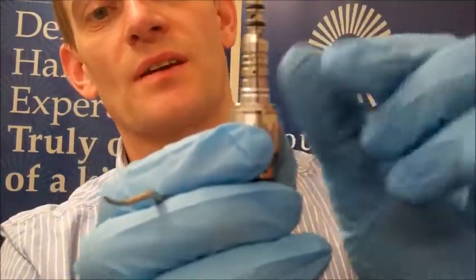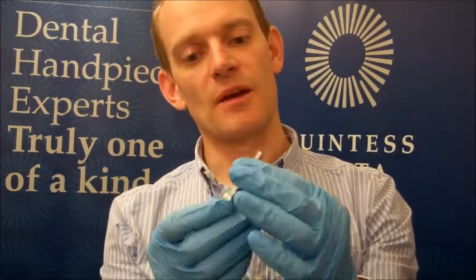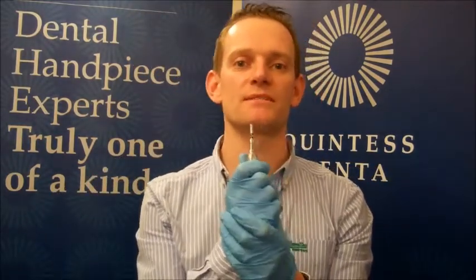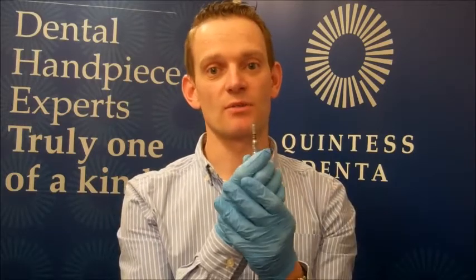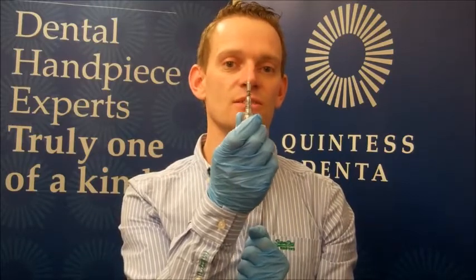Work your way down until you get the other three on as well. Then try your handpiece on it and check to see if the water leak is gone. If it hasn't, there's a chance there's a leak internally in the handpiece itself and it will probably have to be sent in for repair. And that's how simple it is — settable rings, you're talking about five or six pounds. Saves you having to wait to send the coupling in — something very easy that you can do yourself.